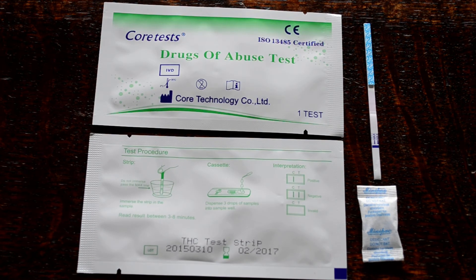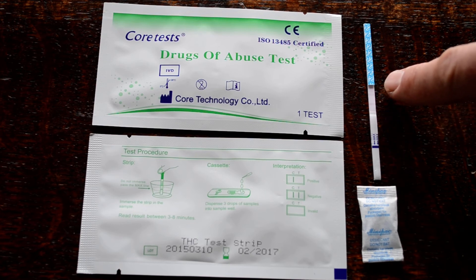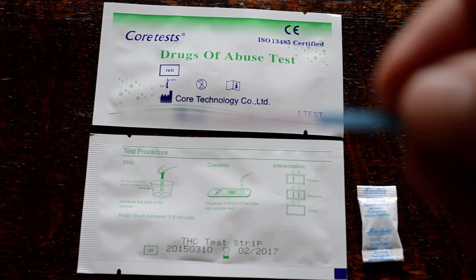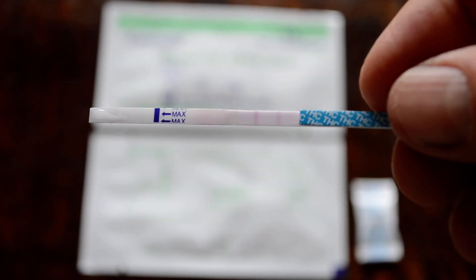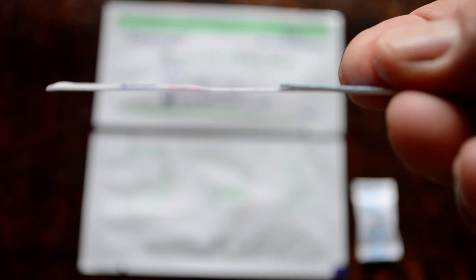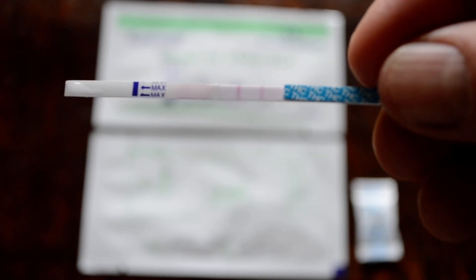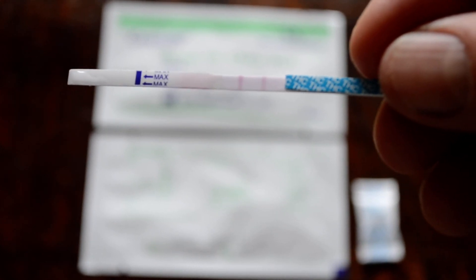You will see the test membrane colour flowing towards the handle end, indicating that an adequate sample has been absorbed by the test strip, and a pinkish dye colour coming out. You can already see the development of a test line nearest the dip end and the control line forming nearest the handle end. Two lines forming in the central section of this test strip. The control line is the line that forms nearest the handle end, indicating that the control has run, and the test line is the pinkish line forming nearest the dip end.